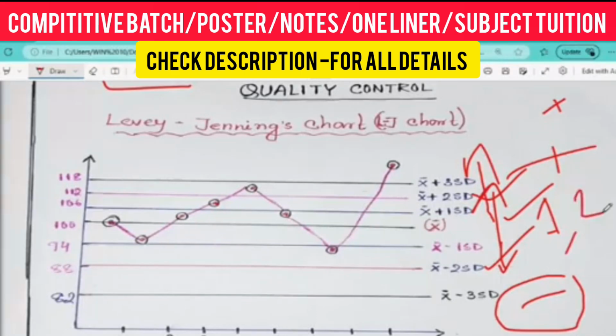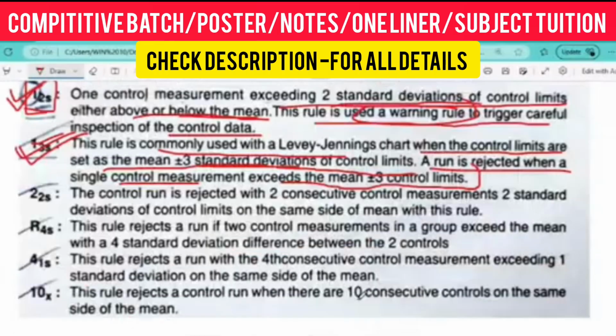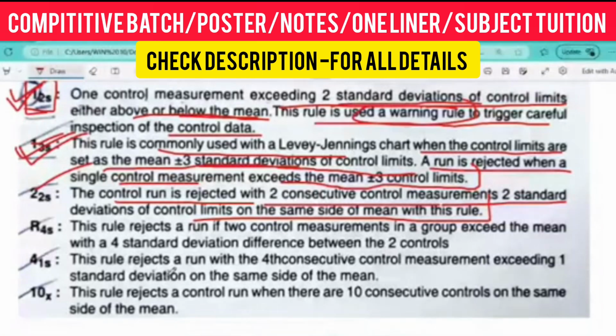Understood? Yes, sir. So 1 3S means if one line is crossed, either on the positive side or the negative side, we cannot take the result. That is a rejected result. Third, 2 2S. The run is rejected if two consecutive control measurements exceed the 2 standard deviation limit on the same side. Understood?